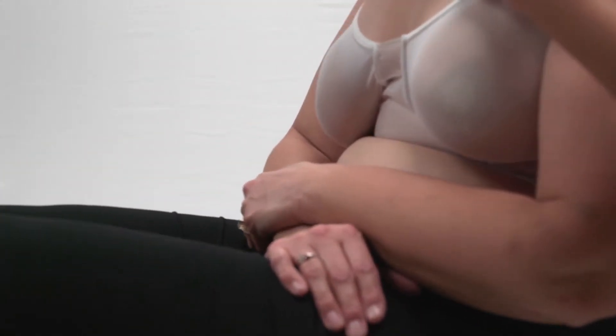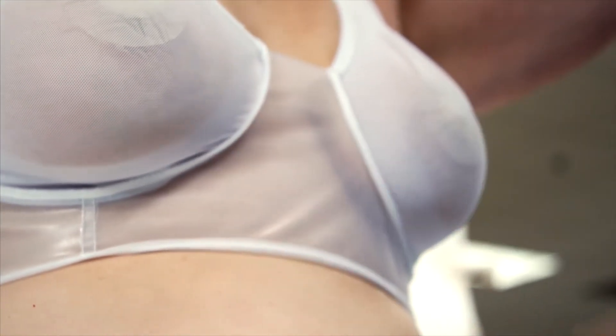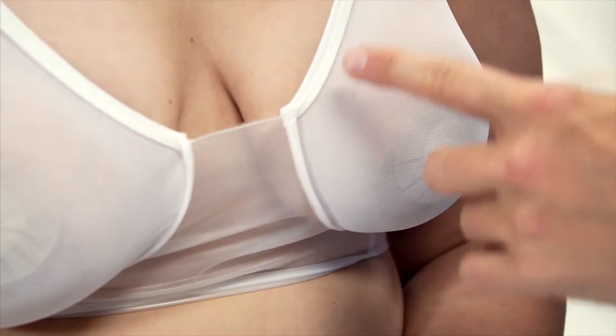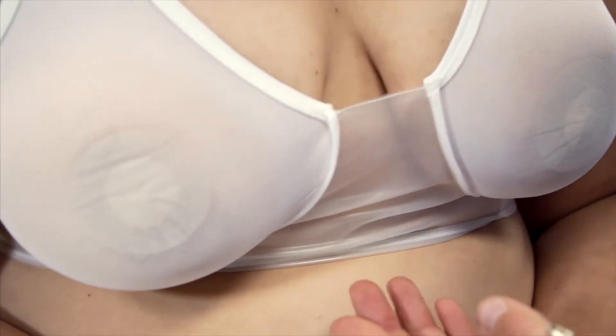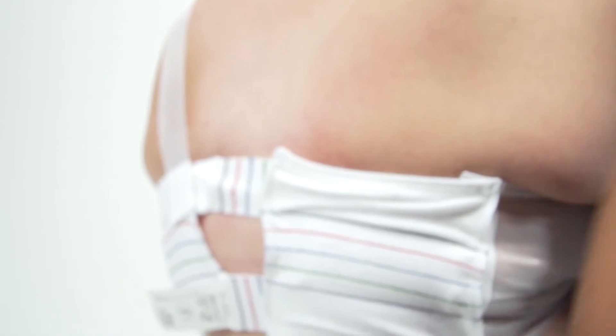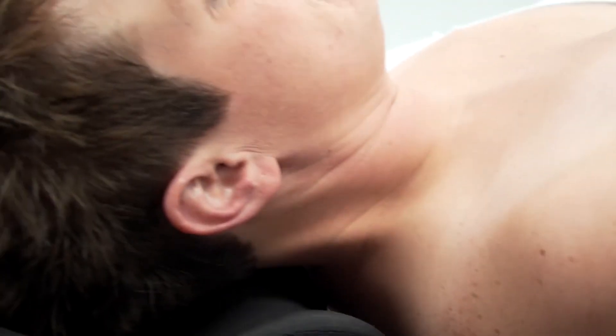Verify all the ipsilateral breast tissue fits entirely in the cup and check for any skin folds. If the breast overflows the cup, you will need to fit the patient with a larger cup-sized bra. You may choose to loosen the strap to allow the contralateral breast to fall laterally and away from the affected breast treatment zone.